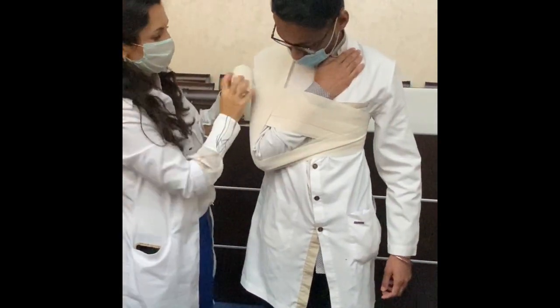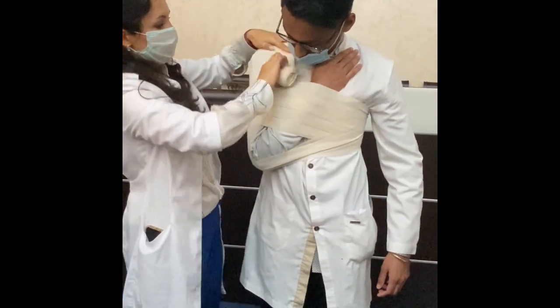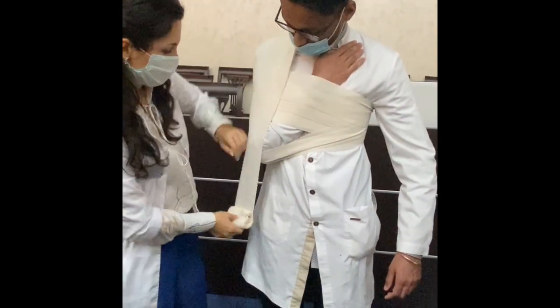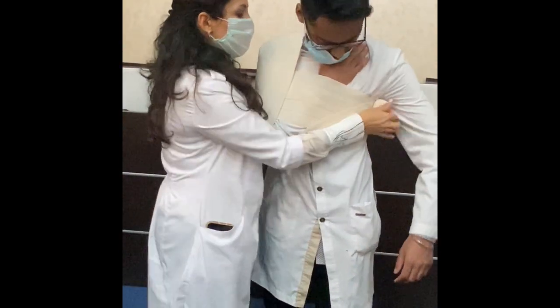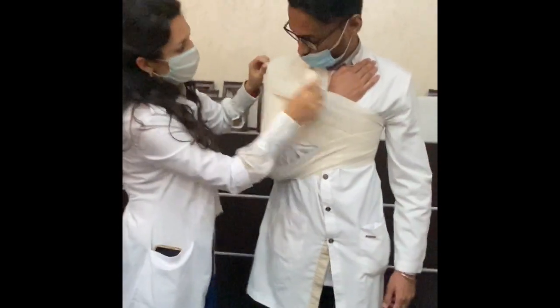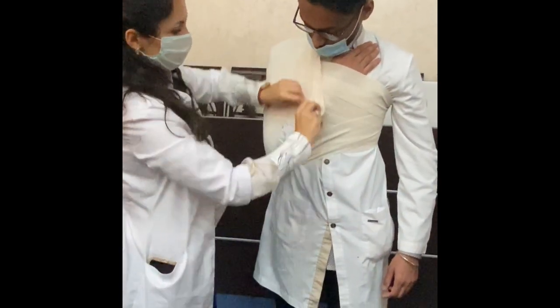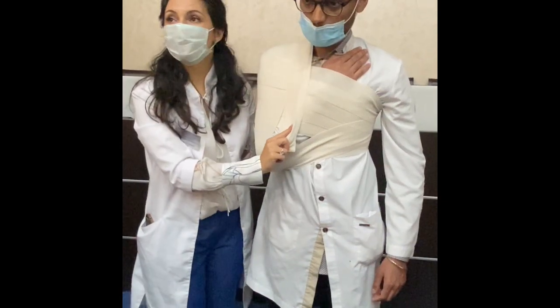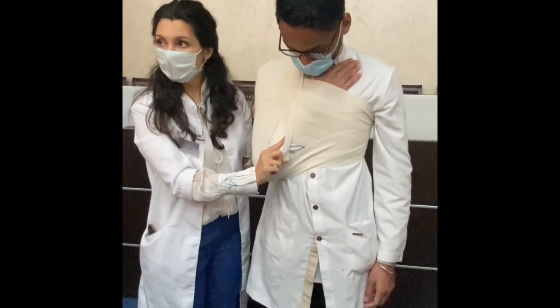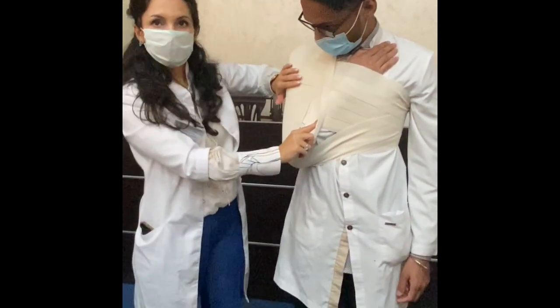Horizontal fixation layers. By the end of the dressing, you have to see what you have got. You have to feel this area — everything should be covered.